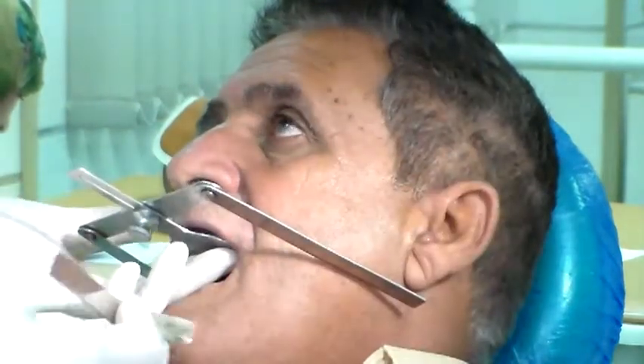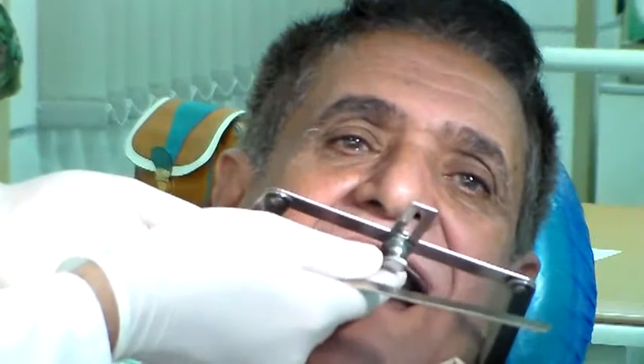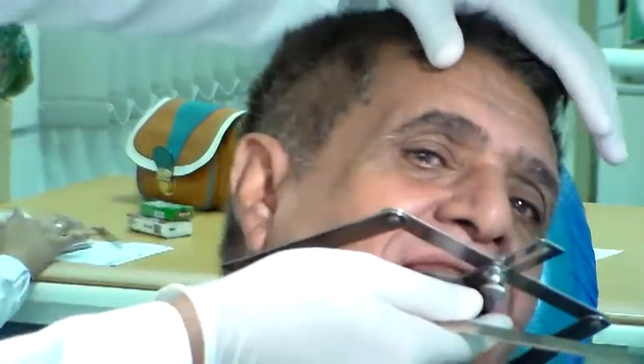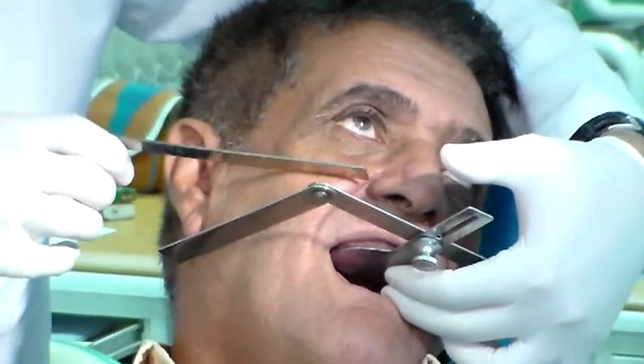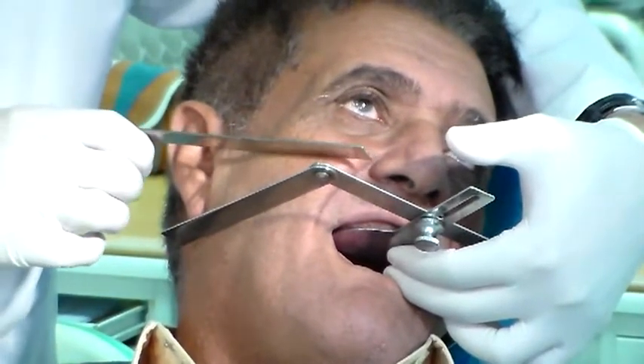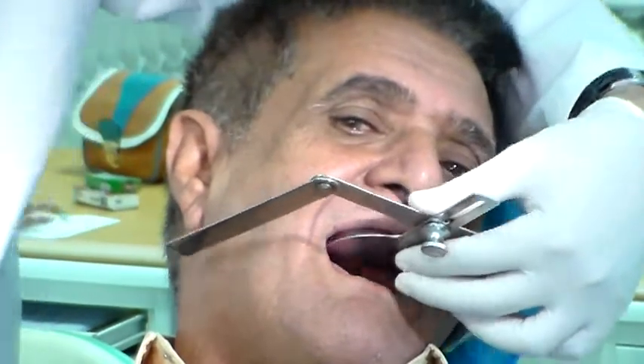So I want to reduce some of the height here. On the other side, turn the patient's face over — place from the ala of the nose to the tragus — and you see there is more space in the posterior as well. So I will reduce this first before I move on.